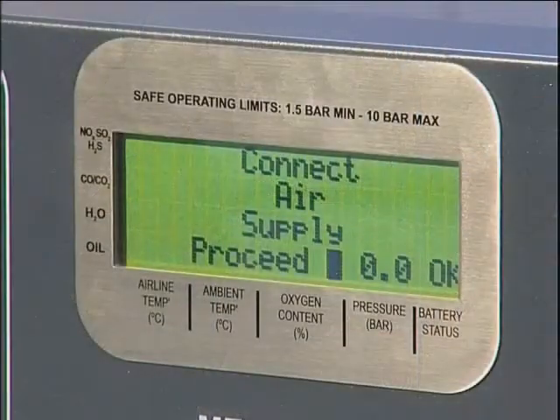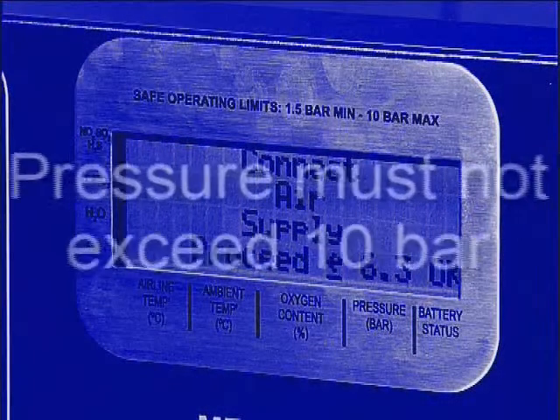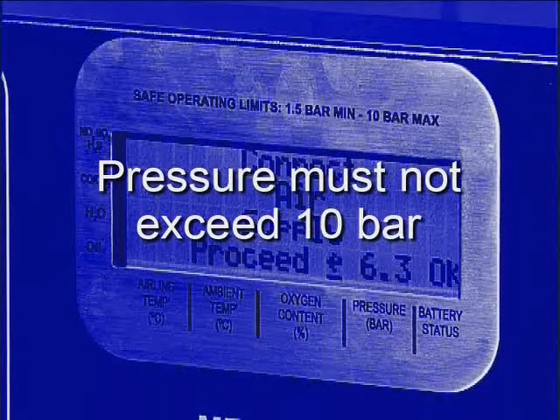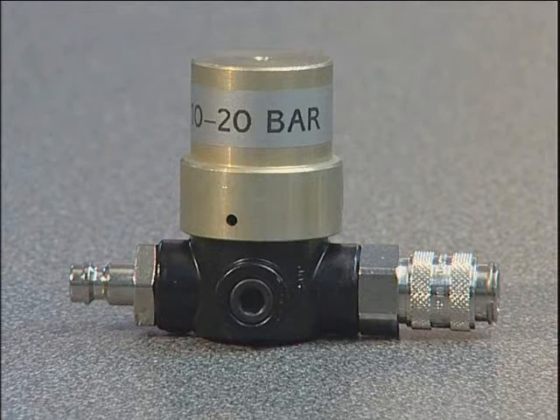The system pressure will be displayed on the tester and must not exceed 10 bar. Please note that if the unit is over-pressurised, it will automatically shut down and display an over-pressure warning. It will then need to be returned to the manufacturer for checking and resetting. An optional F3005 regulator is available for use with systems up to 20 bar.